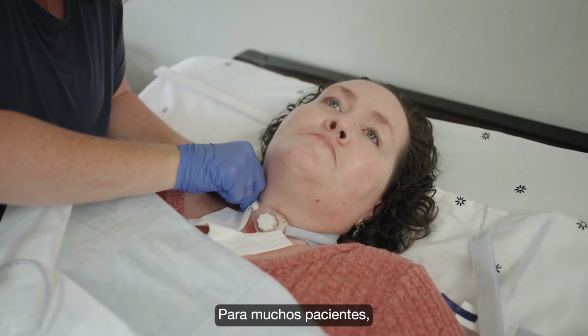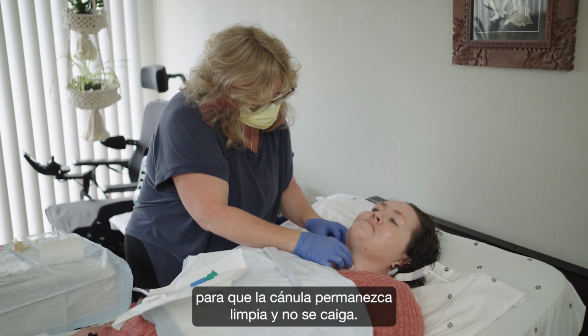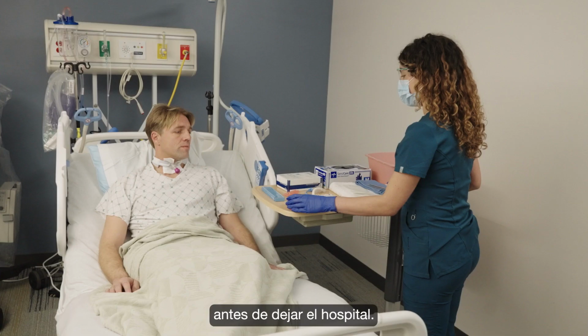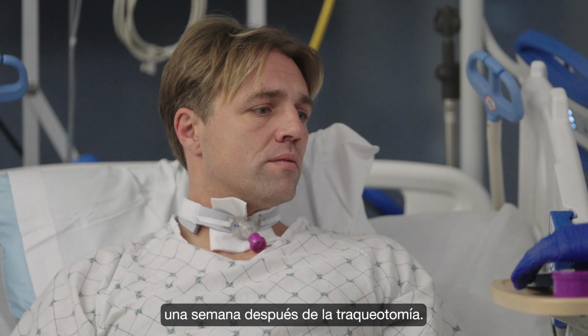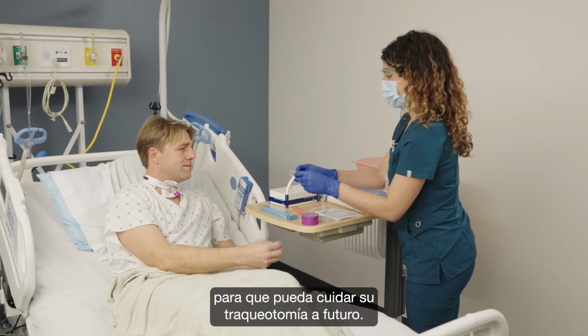For many patients, the trach is their only airway. Great care must be taken to make sure the tube remains clear, clean, and does not fall out. For this reason, caring for a trach will require training for you and any caretakers before leaving the hospital. At a minimum, a patient will be in the hospital a week after receiving a trach. During this time, the care team will provide you with education so you are prepared for long-term trach care.